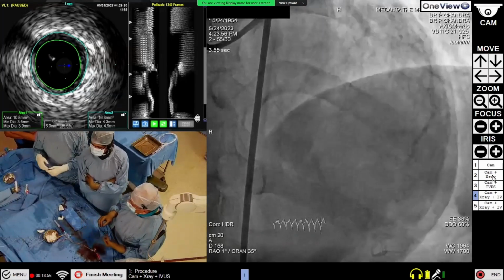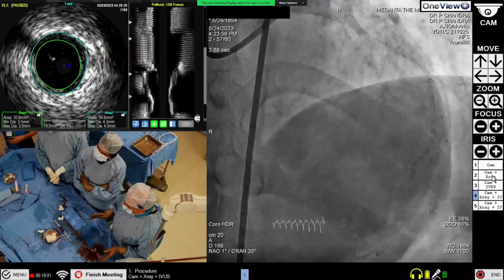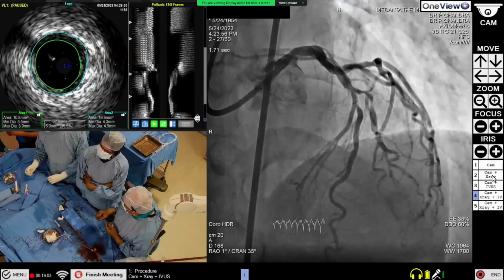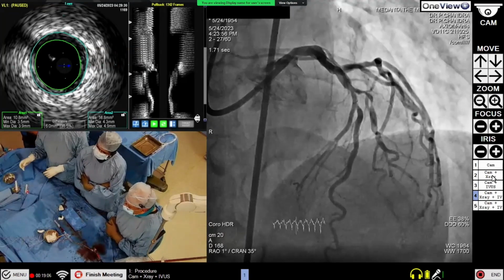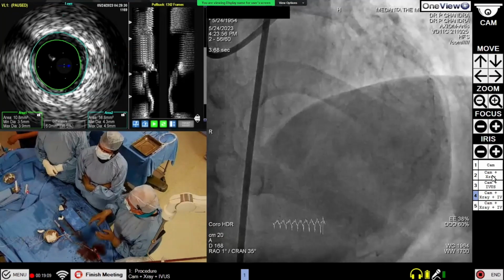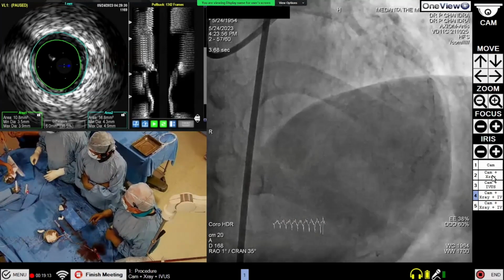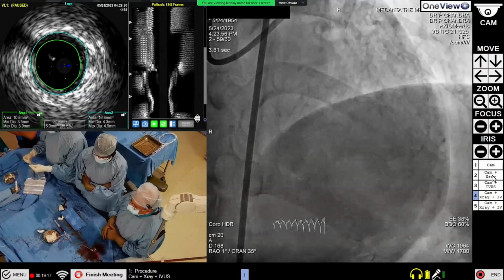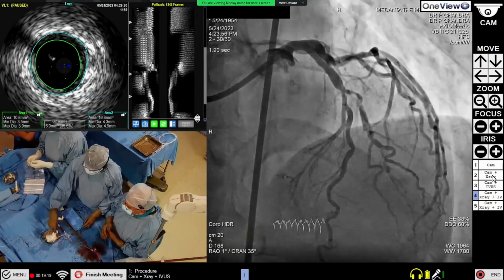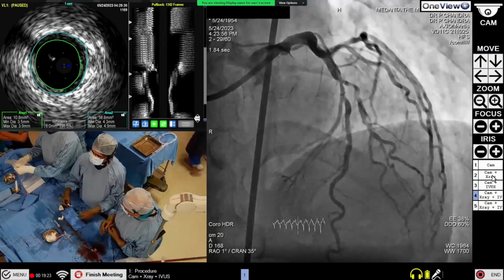The ring lesion of the LAD, see how much we can expand, and if we get a good result with the shockwave balloon and maybe a cutting balloon here if required, and then reassess with IVUS. We already have the FFR wire inside, and we'll see the IFR. If the IFR is normalized, then we don't need to put a stent over here, and we'll do a drug-eluting balloon. So let me see now.